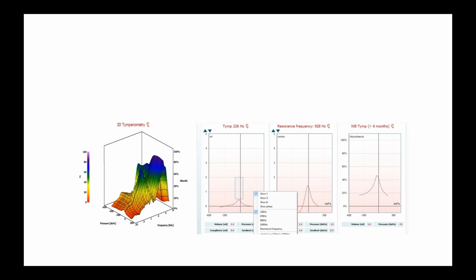Okay. So the next question is why and what is the clinical importance of wideband absorbance, and is it necessary to include this in the current audiological test battery? I think you've already covered this quite comprehensively, ma'am. But you can correct me if I'm wrong. I think you are saying that we should not replace it with any test, but we should just add this as a part of the test battery.